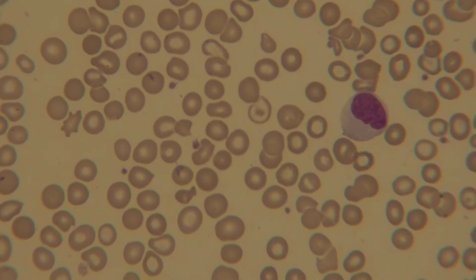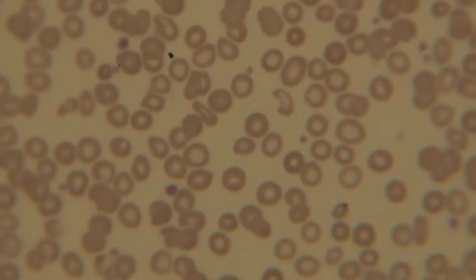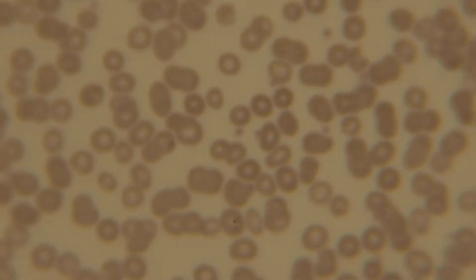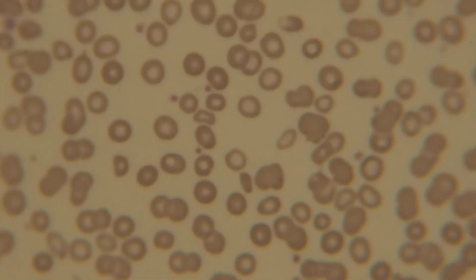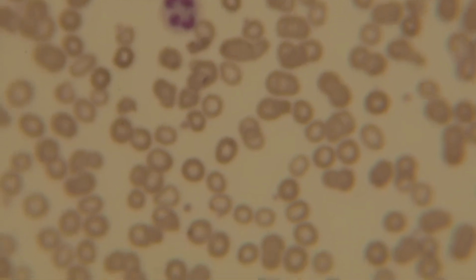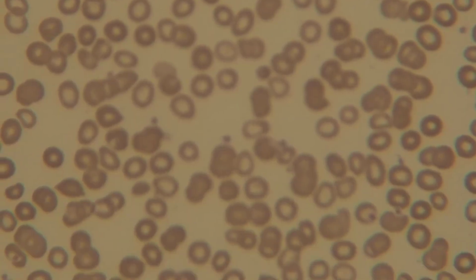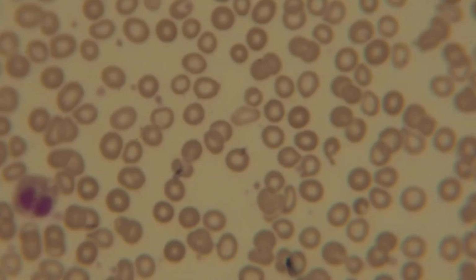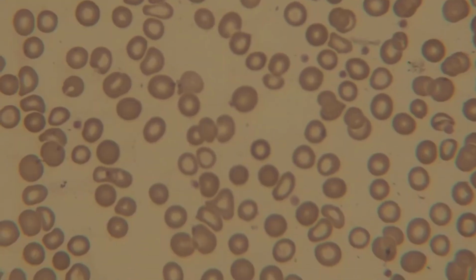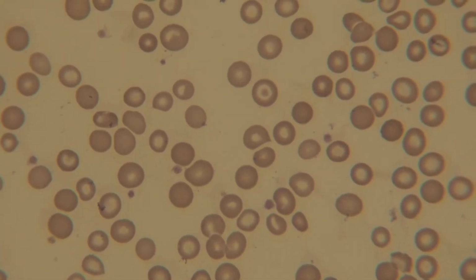Monocyte, neutrophil, neutrophil, eosinophil, very pretty target cell, guys.